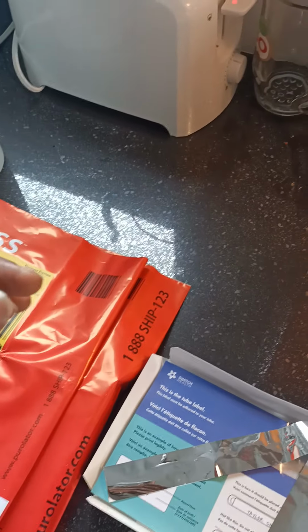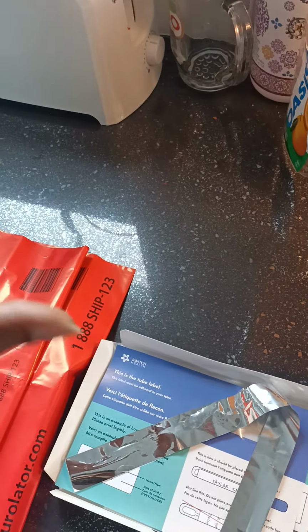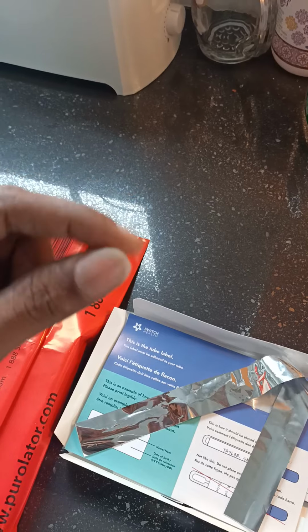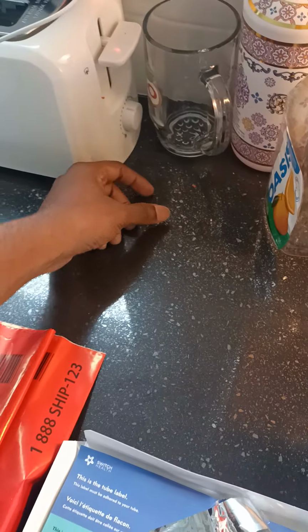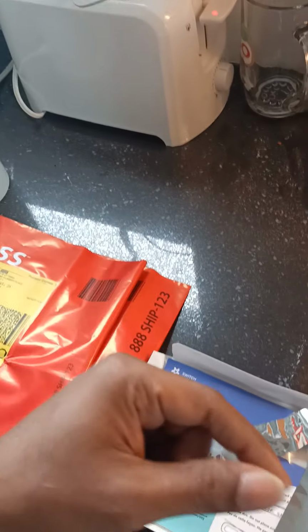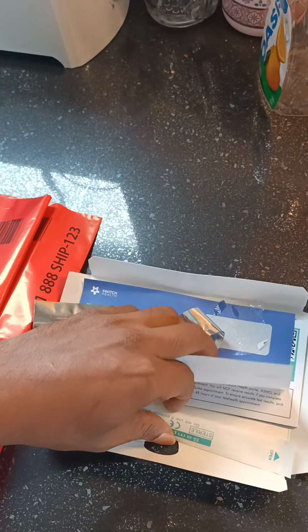I got a nurse online, and then she asked me to open up the tube inside the package. I opened the tube, then she asked me to open up the cap of the test tube and just put it on one side. Then she asked me to remove the nostril package, which is this one.